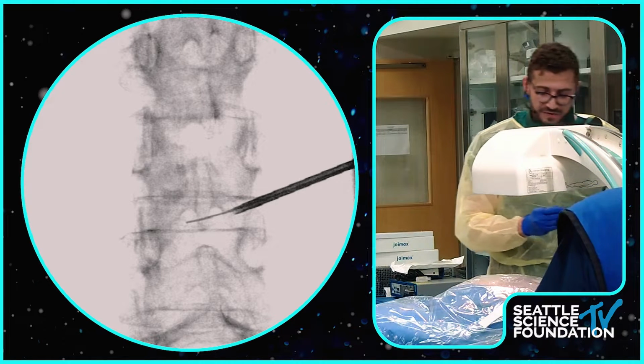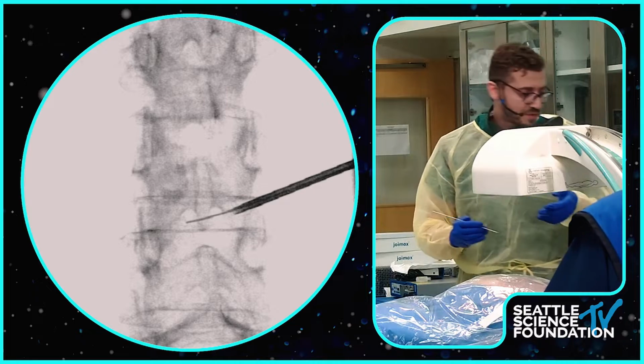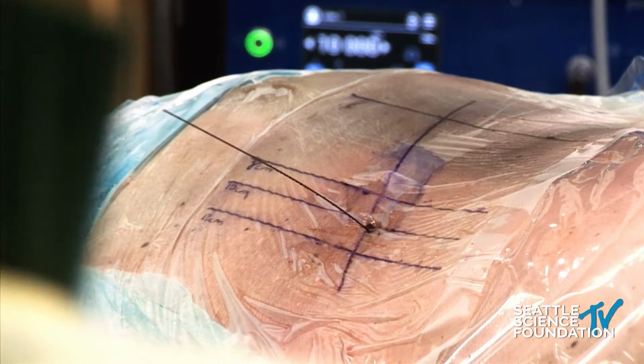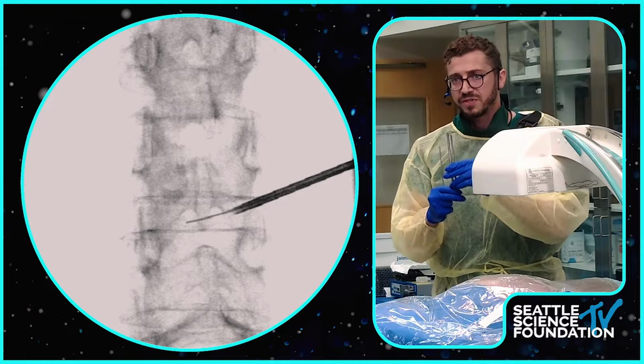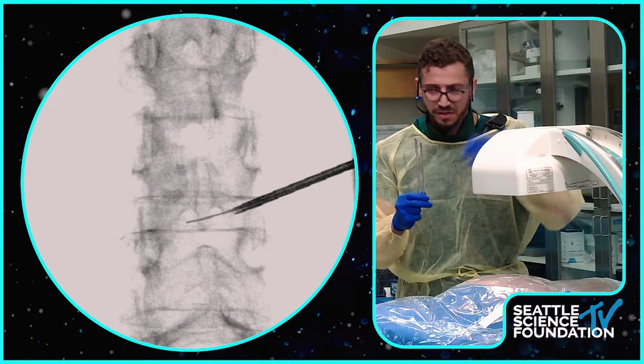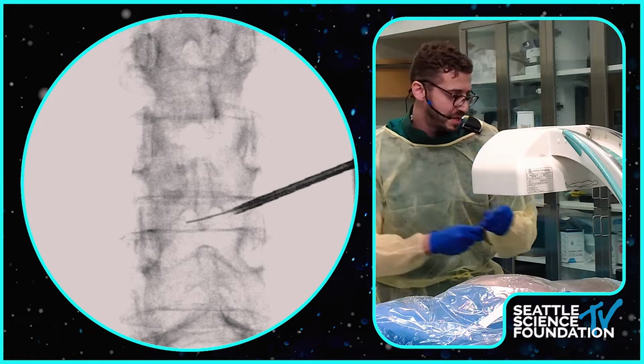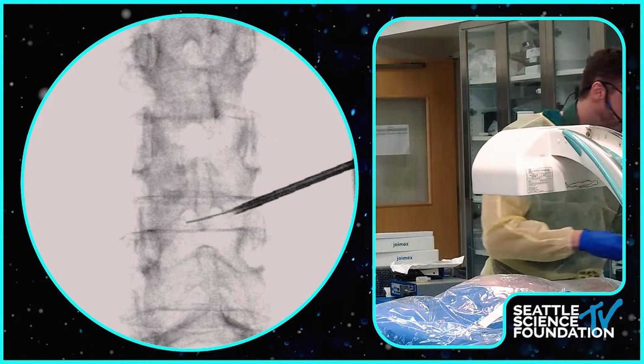There are multiple ways of doing this. This is a huge foramen, so there are multiple different sizes of reamers here. You could start with a small reamer, go to the middle-sized reamer, and then go to the largest reamer. The safest thing to do when you're first starting is to go from smallest to largest. Here in a large foramen, I'll probably just go straight to the largest one, especially in terms of time, so that we can get to see the interlaminar approach.